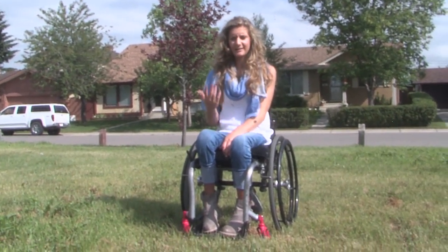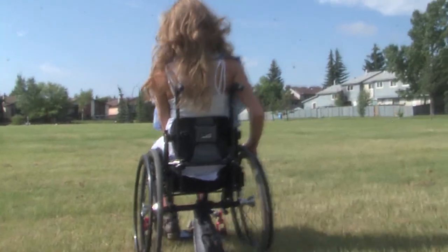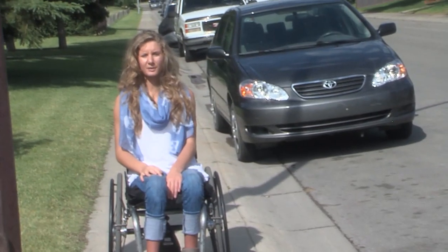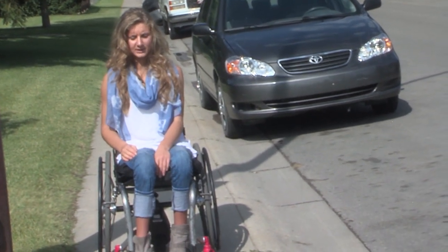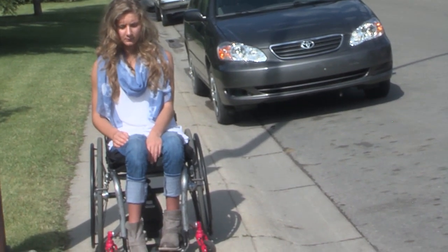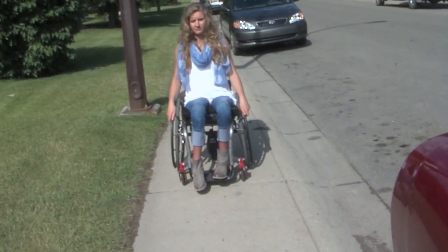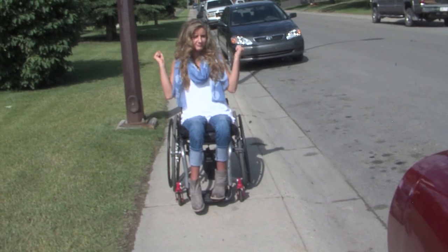Now that I have the SmartDrive I can just press the button and take off and go wherever. When you want to brake, it's just like how you would brake normally — I'll engage the SmartDrive, and when I want to stop all I have to do is put a little friction on my wheels and voilà, I stop.